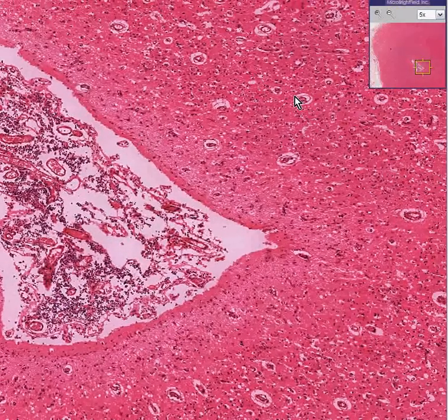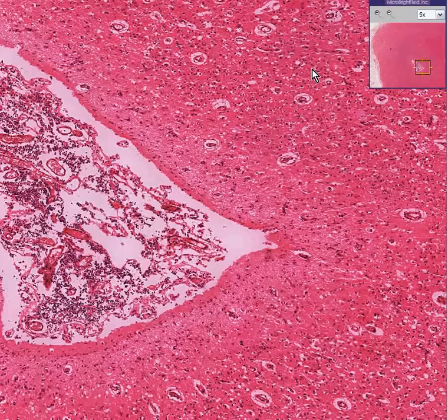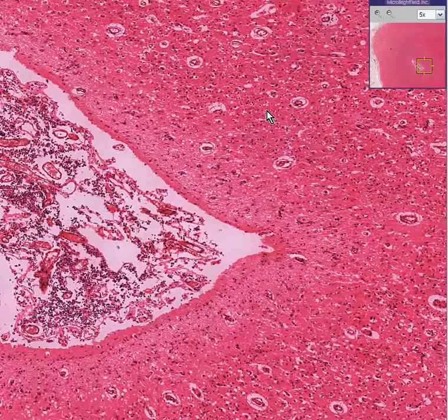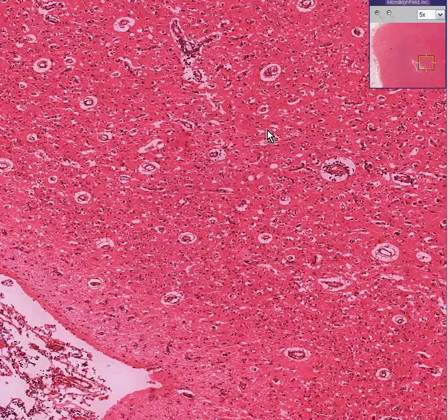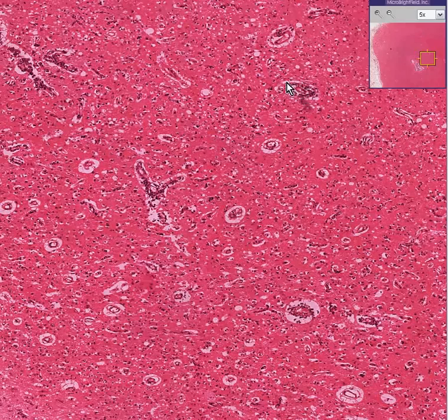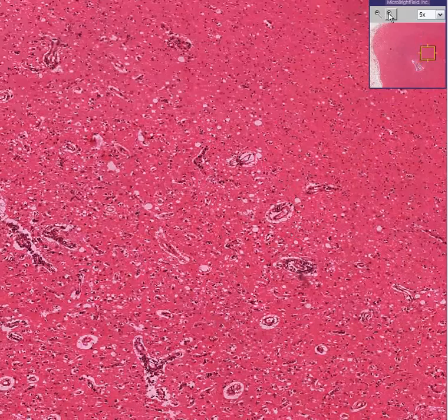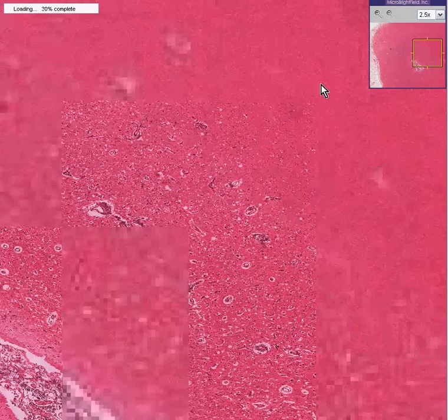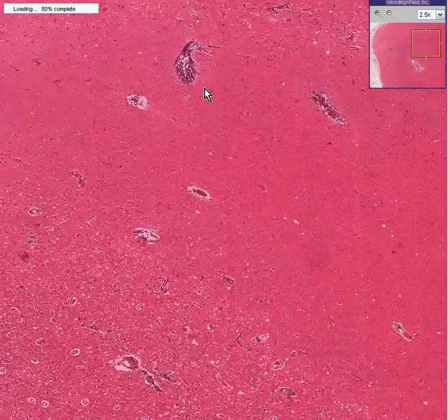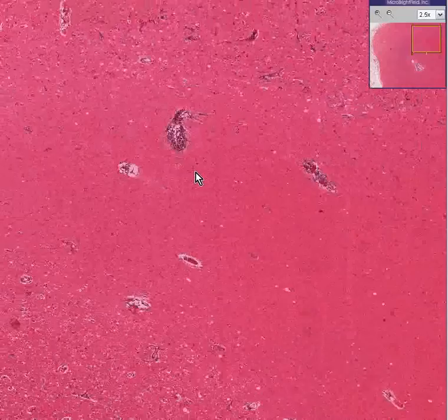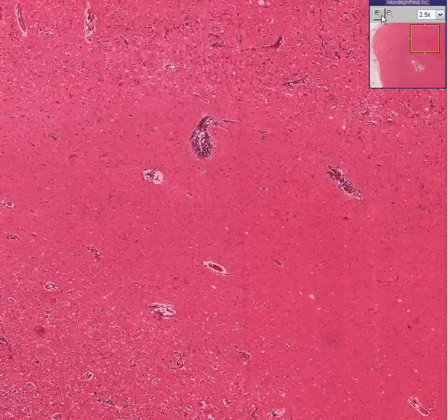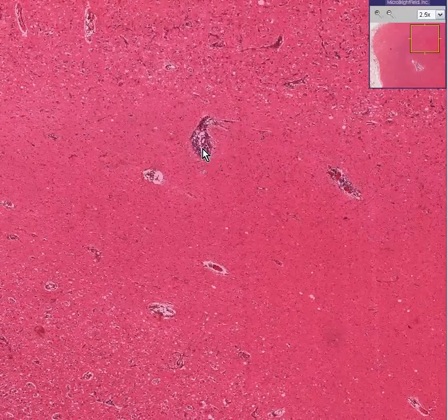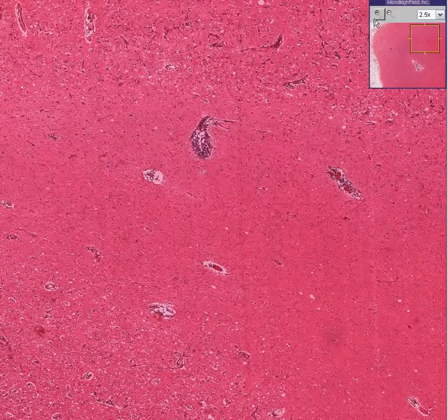In addition to having increased blood vessels, some of which are cuffed by inflammatory cells, gliosis, we also see blood vessels in which there's a significant cuffing of lymphocytes around the blood vessels as well, like here and here and here.